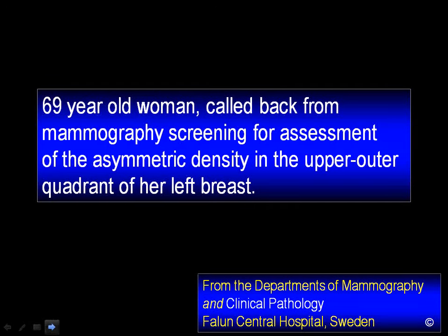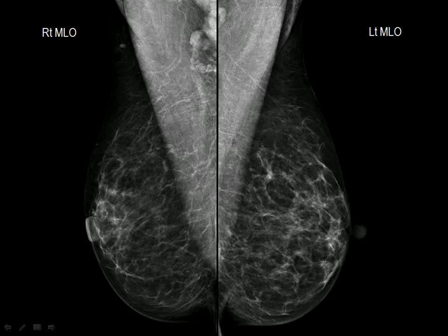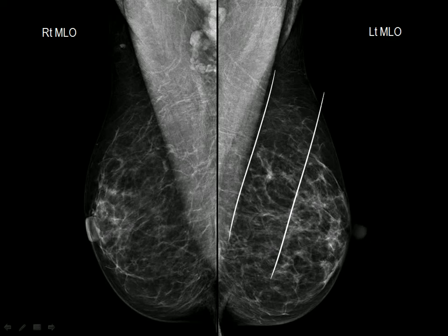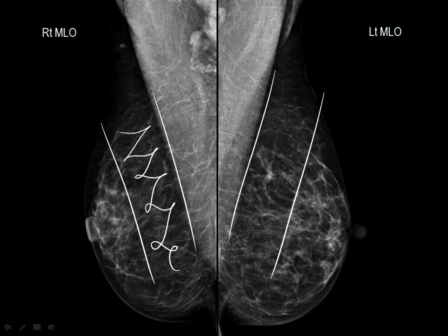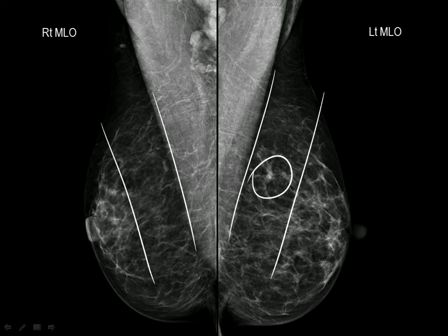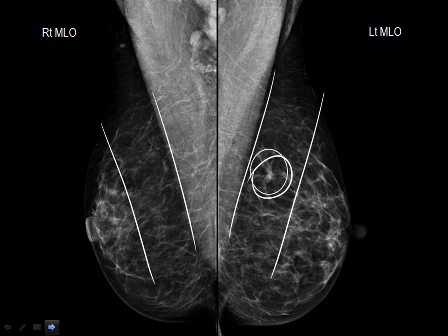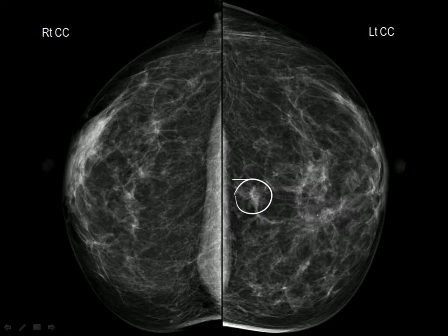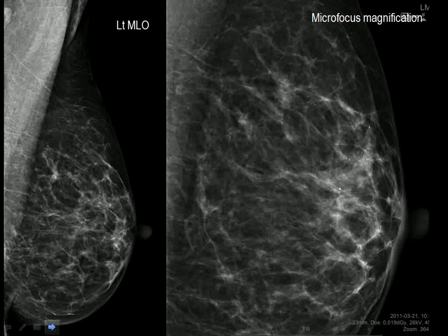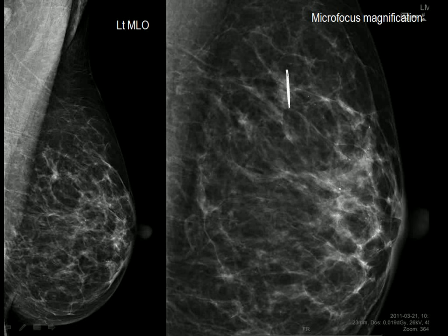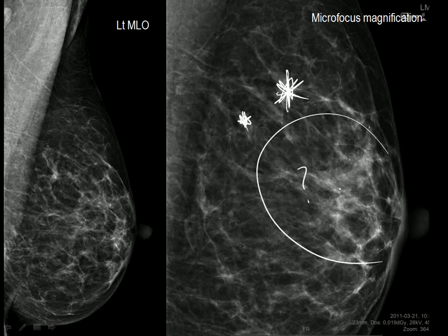Let me demonstrate it by showing one single case. A 69-year-old asymptomatic woman comes to screening. You are skillful enough to find immediately the non-specific asymmetric density here — there is only adipose tissue on the other side. When you look at the CC projection, the lesion is here, with no such density on the other side. When you magnify, you see actually two very small stellate lesions, and there are some calcifications as well.